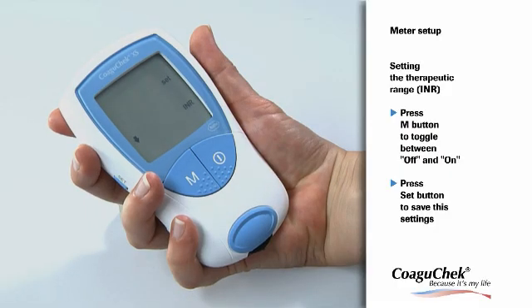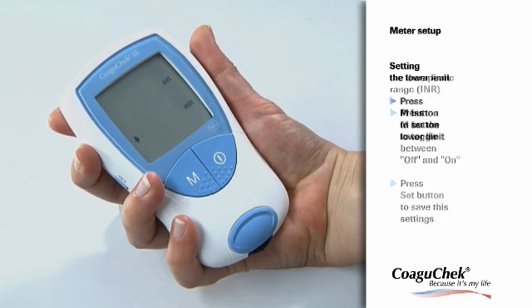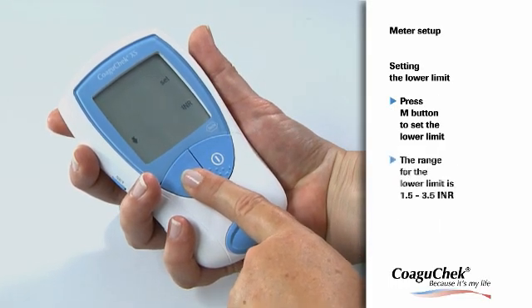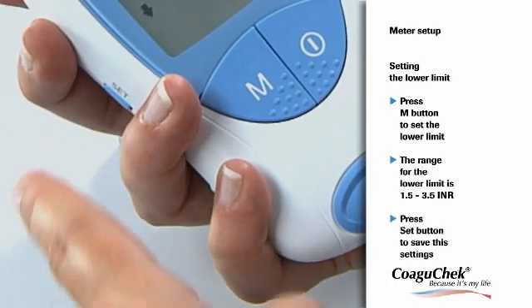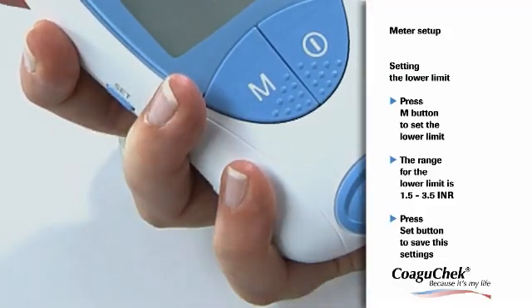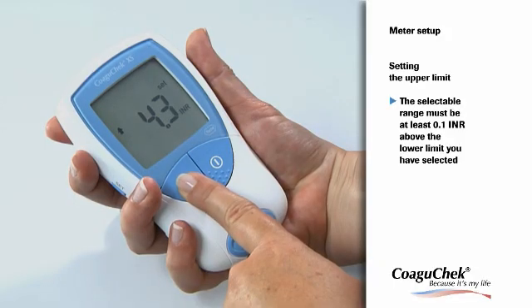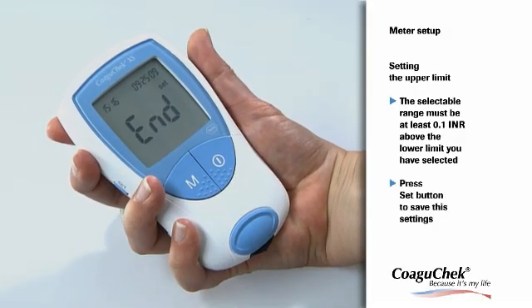If you have decided to use this function, you are now able to enter the limits of your target range. Consult your doctor about which target range is appropriate for you. Press the M button to set the lower limit within the range of 1.5 to 3.5 INR, and press the Set button to confirm. Then press the M button to set the upper limit within the range of 2.5 to 4.5 INR, and again press the Set button to confirm.